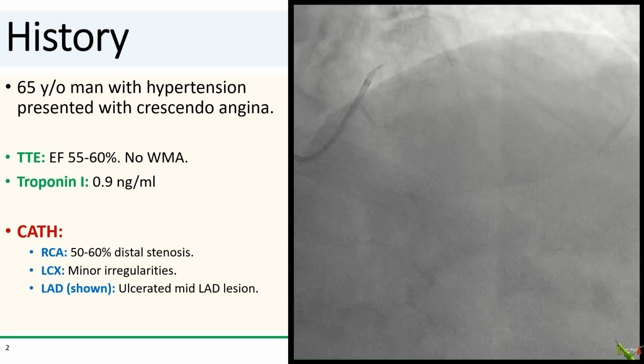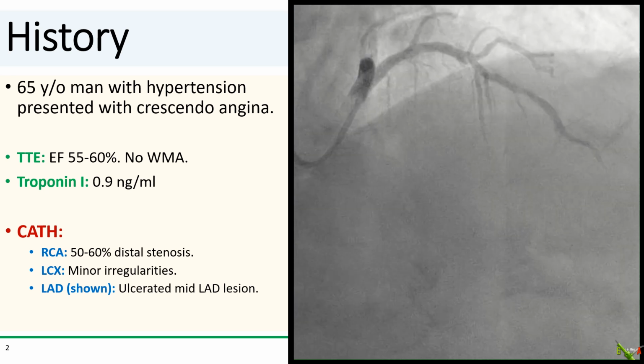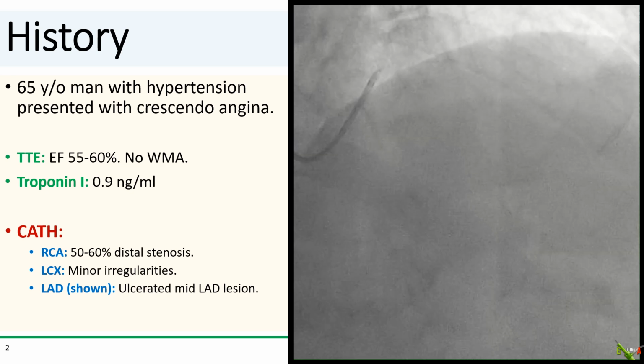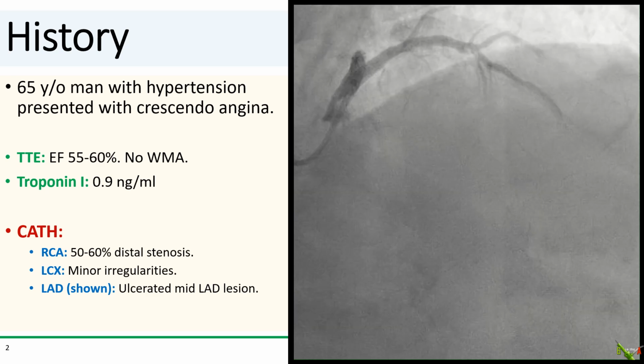On cath, the RCA had a 50 to 60% stenosis distally. The circumflex had only minor disease, and the LAD is shown here. There is clearly an ulcerated lesion in the mid-LAD, which we thought was the culprit lesion.